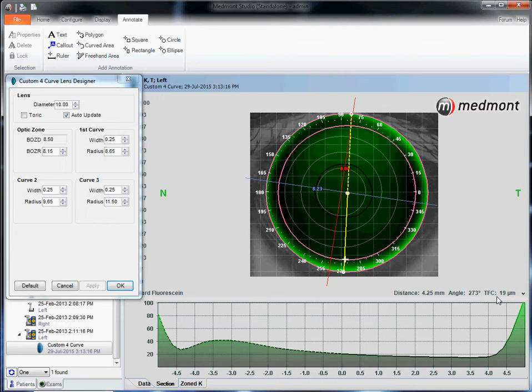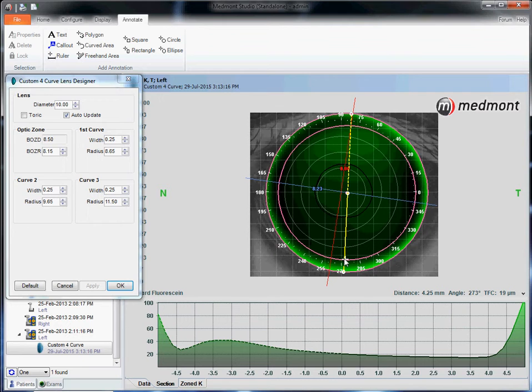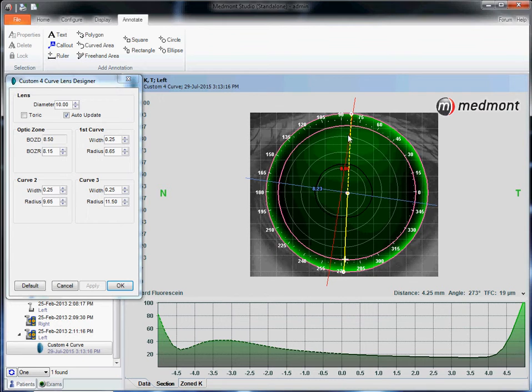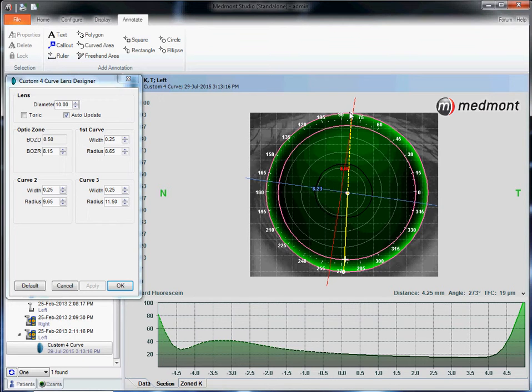When there's under 40 microns of fluid at the edge of the optic zone, that typically means a symmetrical RGP lens will work well. We do not need a toric. When it's over 40 microns of fluid thickness at the edge of the optic zone, that's typically where a toric or some kind of asymmetric RGP may be required.